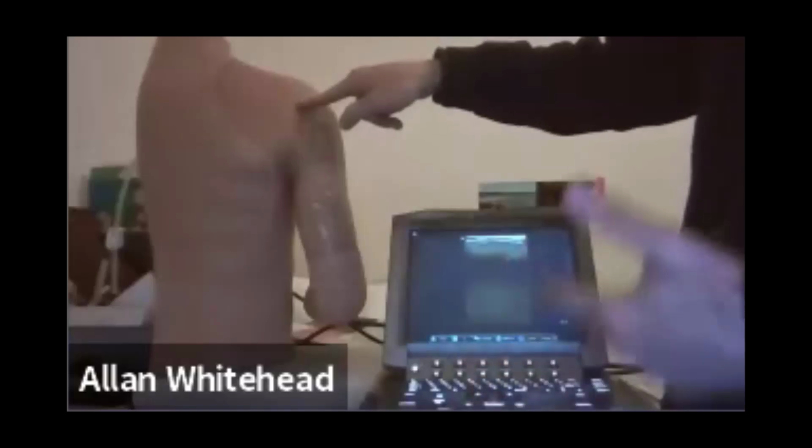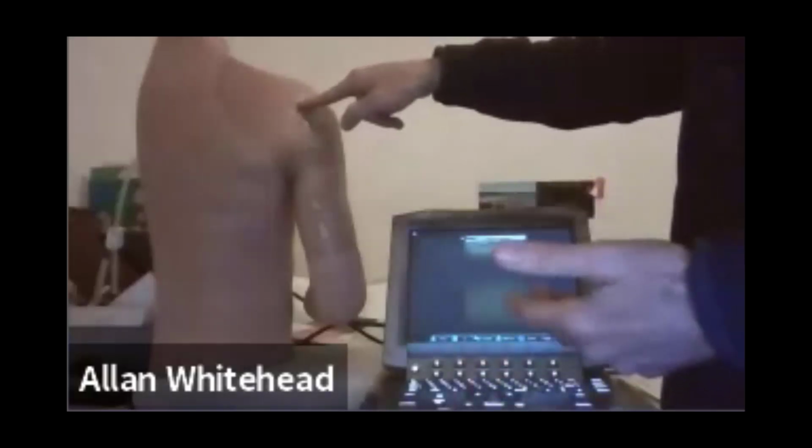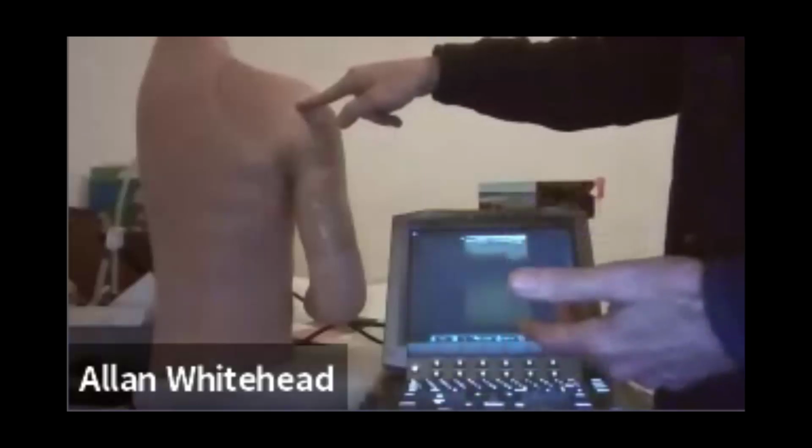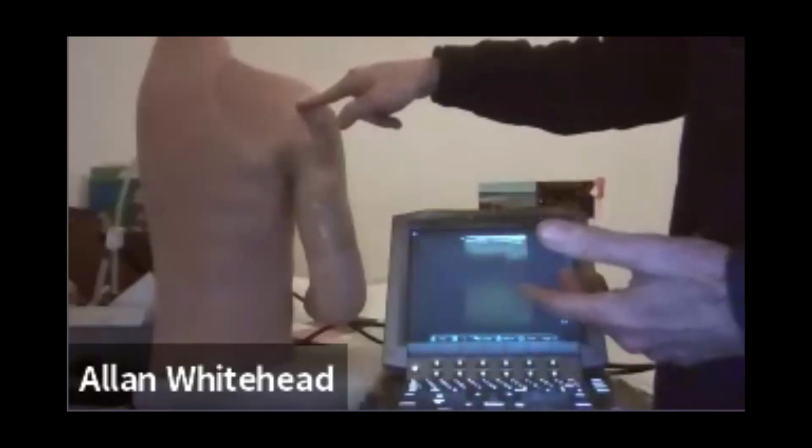And this is, again, replicating what you're doing with the intra-articular injection. So instead of aspirating the joint, like for an effusion, I would be injecting the joint to do the anesthesia for my dislocated shoulder. But the good news is I've got a much bigger target because I don't have to be so precise. Here I've got to be semi-precise because it's not that big an effusion if I was ever going to try and tap it.